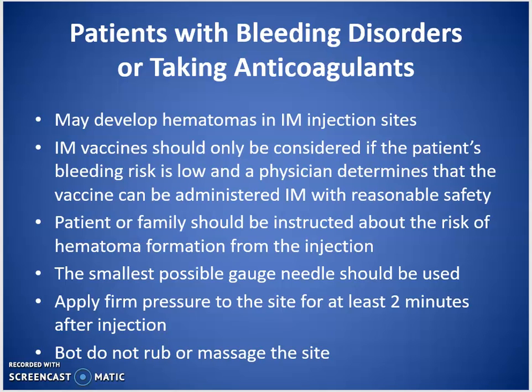That's never a good situation for any injection, I found. Sometimes patients will rub the site. That's their choice. It's their body. I've seen MAs do it, and patients have various reactions to it. Some see it as comforting. Some see it as irritating. So it's best just to deliver the injection and leave it at that. And don't, by the way, you'll see this sometimes in practice.